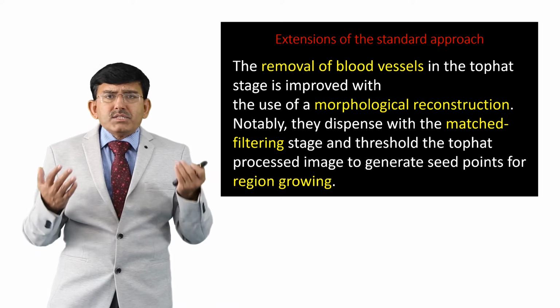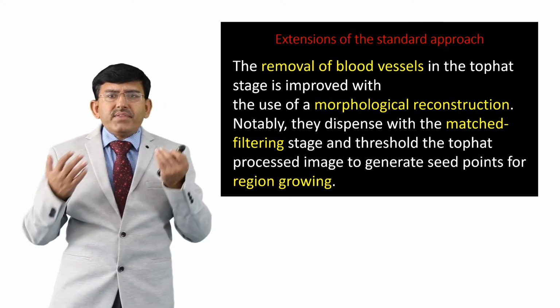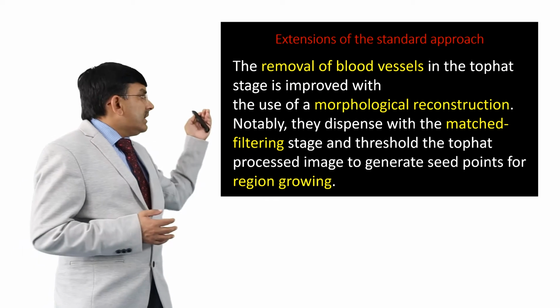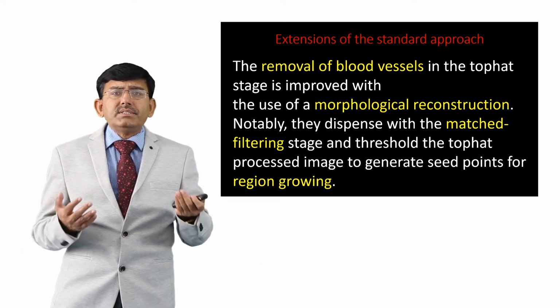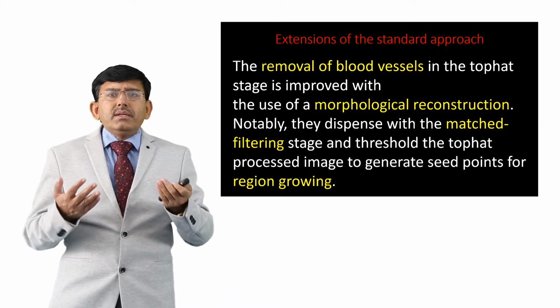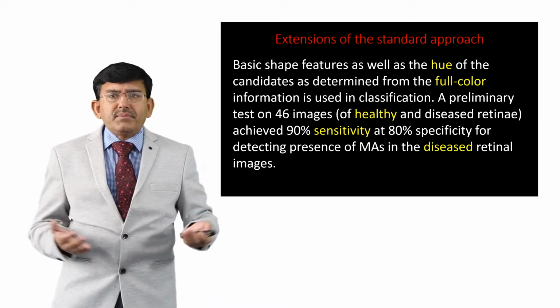Notably, they dispense with the match filtering stage and threshold the top-hat processed image to generate seed points for the region growing technique. Basic shape features as well as the hue of candidates, as determined from the full color information, are used in classification.